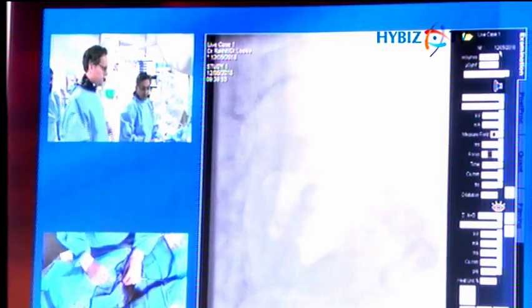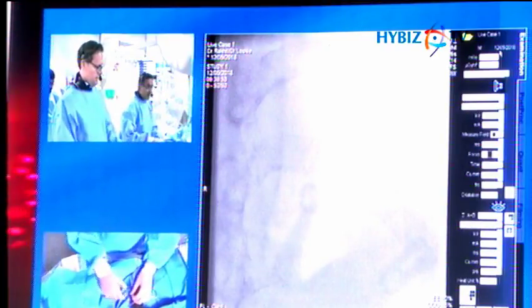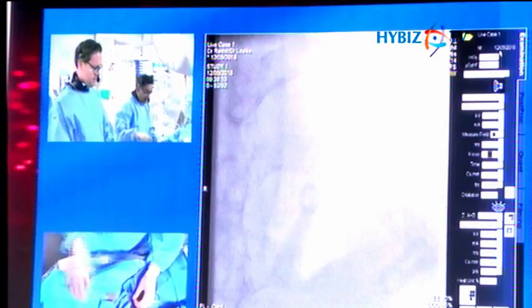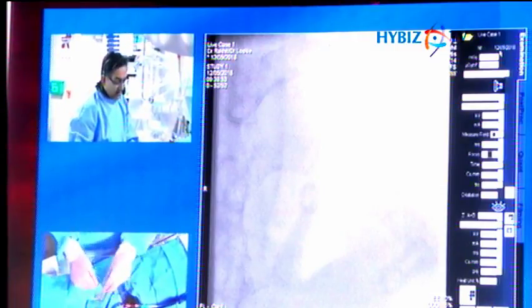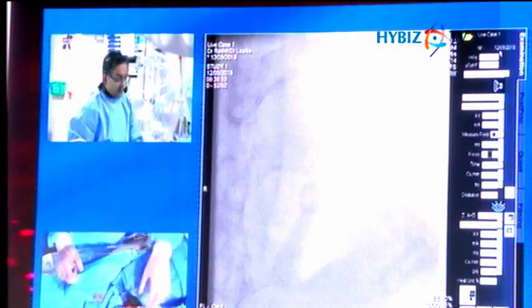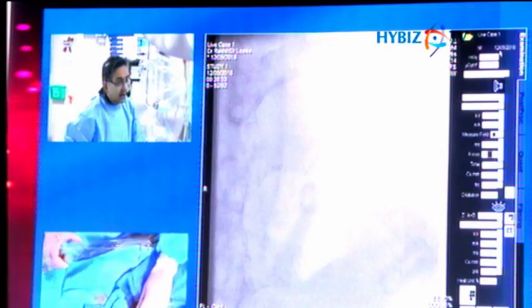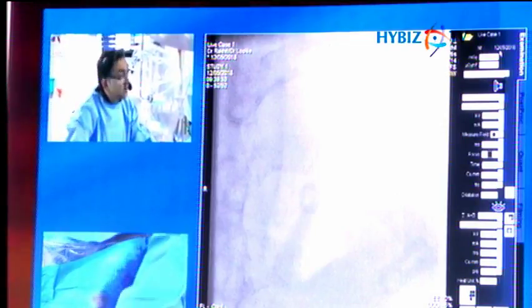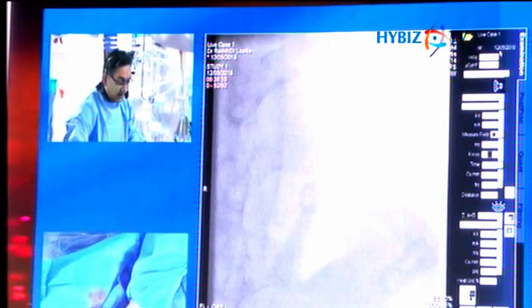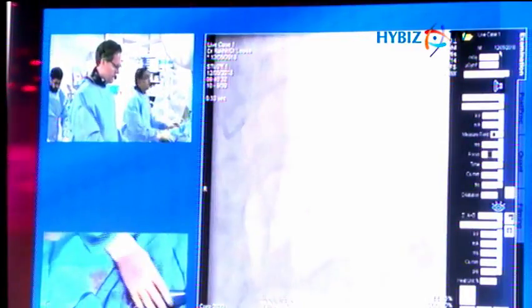Are you going up with an NC balloon? No, we've just taken a 2.5 SC, and we're now going to go up with an NC. You may have seen the waist with the 2.5 at 20 atmospheres. The OCT did show that calcification, so I think the prep is going to be good. Definitely. It's not circumferential, but there is an arc of calcium between 3 o'clock and 6 o'clock. So we're going to now go straight with a 3.5 NC. We're using the Emerge Boston balloons, which is our workhorse balloons at the moment, and we're going to use that to also confirm the distal size.